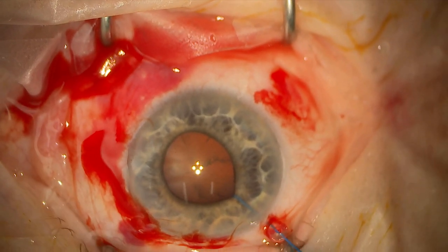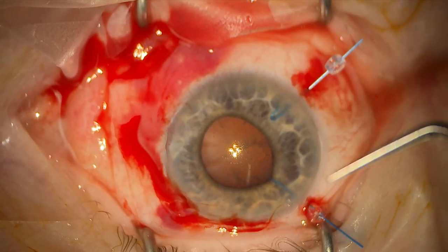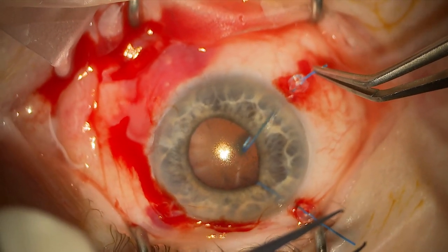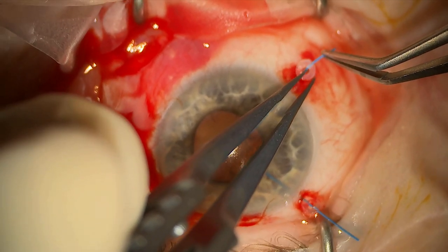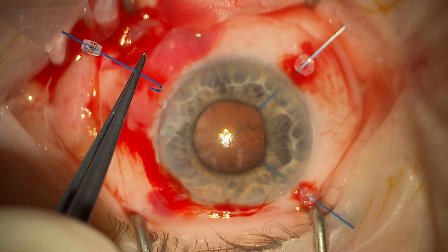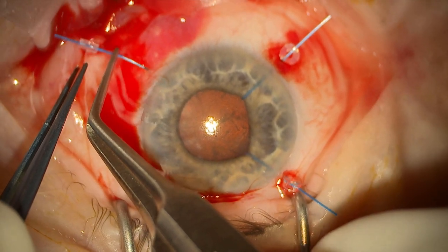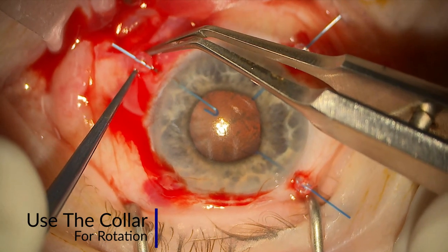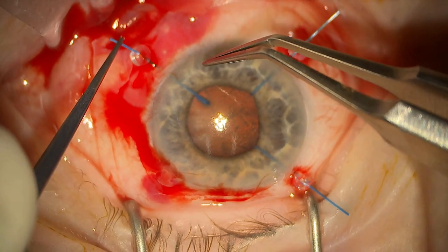I don't pull just yet — I just hook it under the iris and tighten up the collar to make sure it doesn't move, and I'll be putting my second, third, and fourth iris hook here. Another small tip to help you manipulate and rotate the iris hook is to rotate the actual collar itself. When you rotate the collar, the hook rotates with it, and you can rotate the collar to ensure that the hook is under the iris appropriately when you are pre-placing.